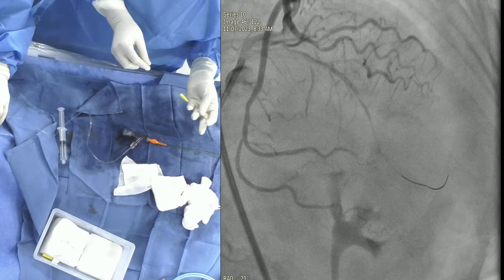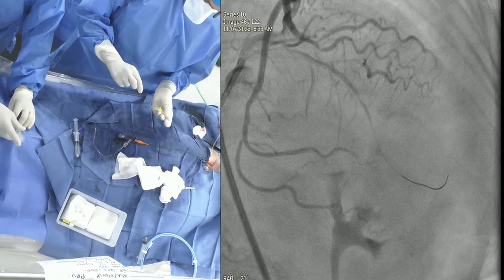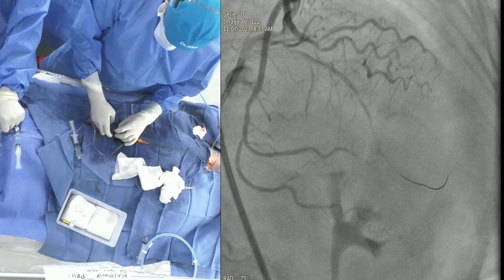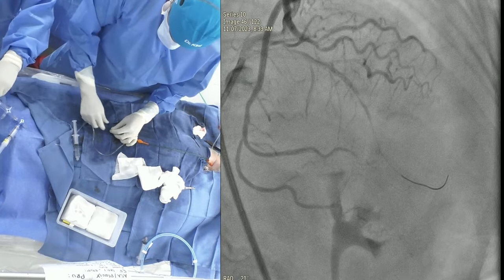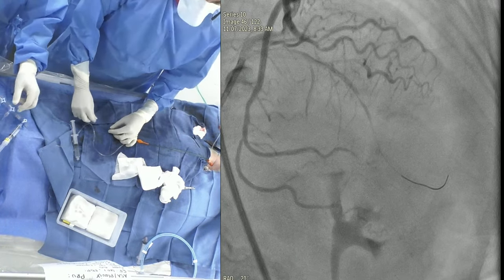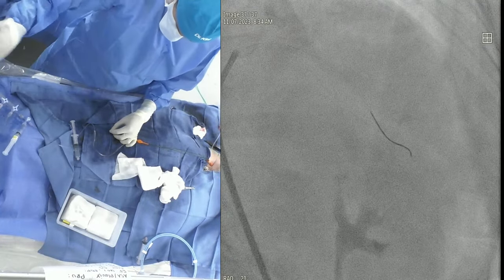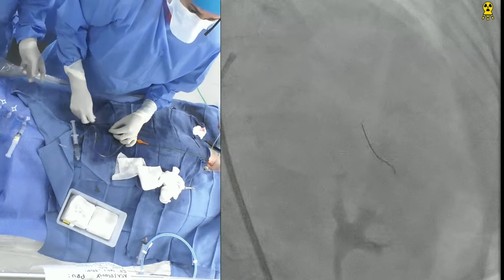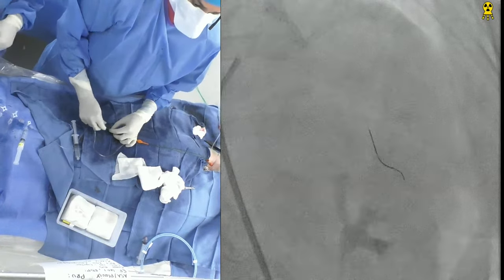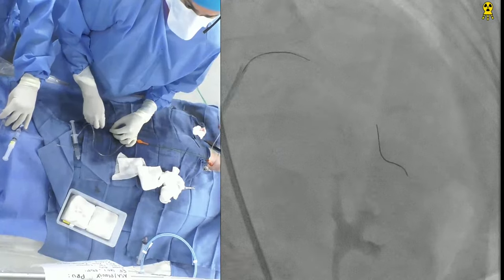So you want to put a 38, 2.5? Yeah, 2.75. No, no, distal is not 2.75. Okay, 2.5, 38, we can always enlarge the stent after. You want another picture? No, we'll continue there. So now we are trying to wire the diag, the same fielder wire that we used. And the diagonal also looks to be a pretty large vessel.